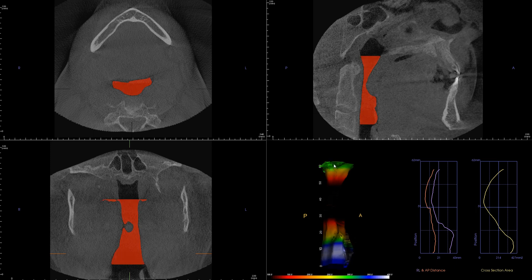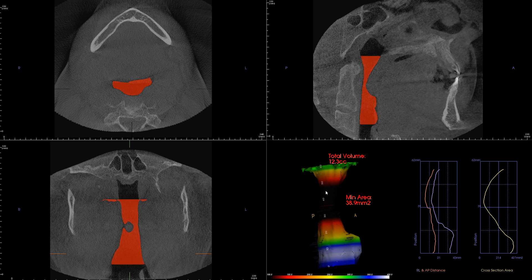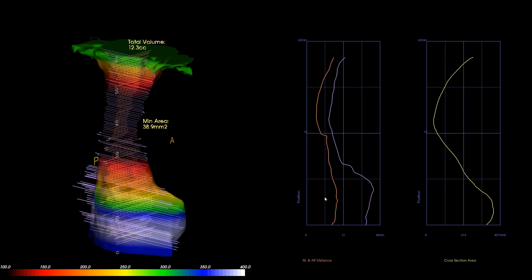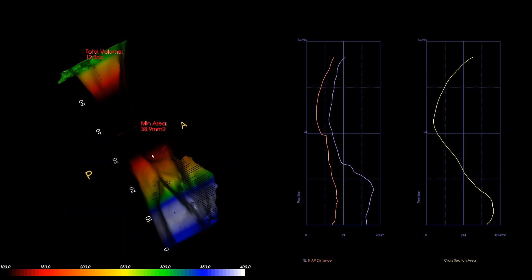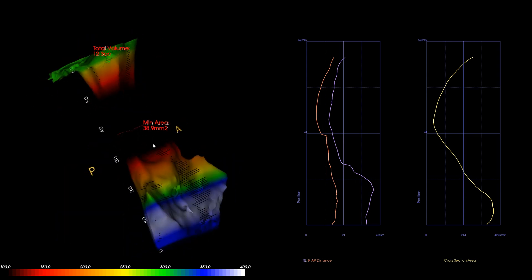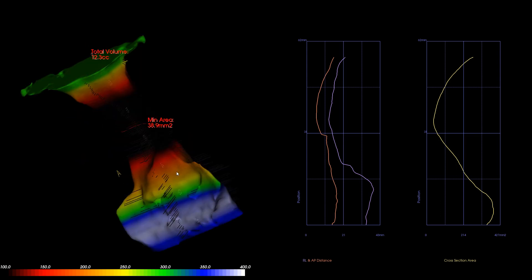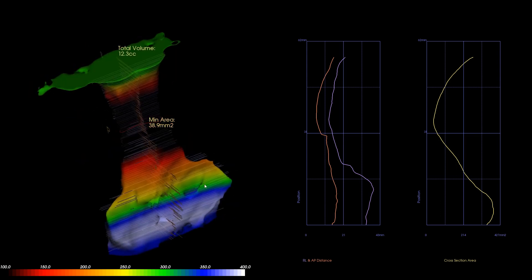Now let me highlight the volume. What you're seeing here is the 3D rendition of the airway. We have an estimated volume of 12.3 cc based on the way I highlighted it. Obviously if I change the border of the airway it will be different, but I want you to see the minimal cross-sectional area, which is estimated at 38.9 — that is very small, a very constricted airway.